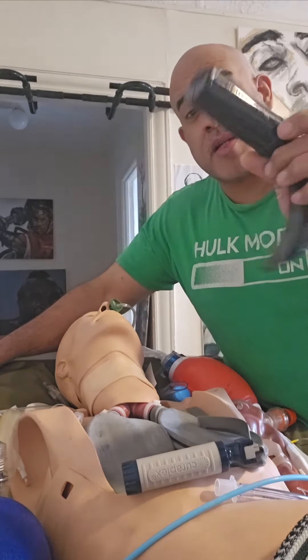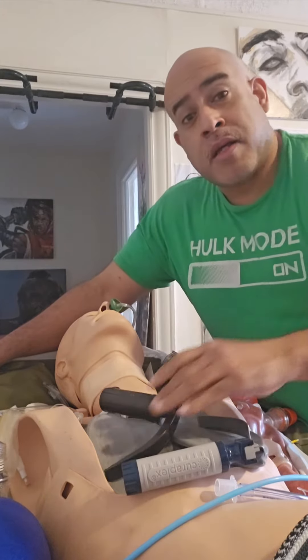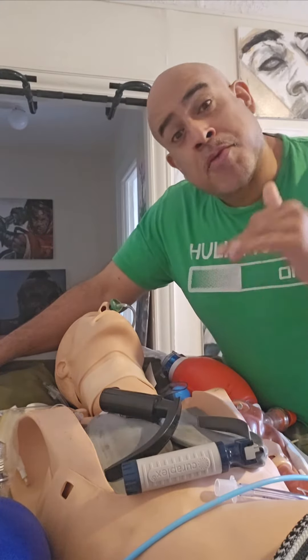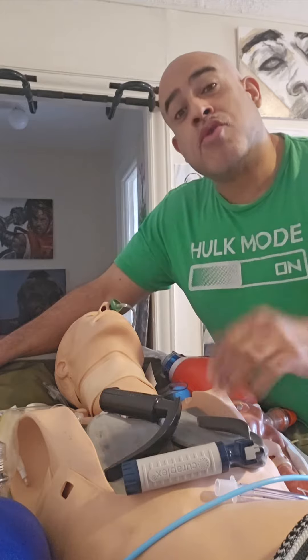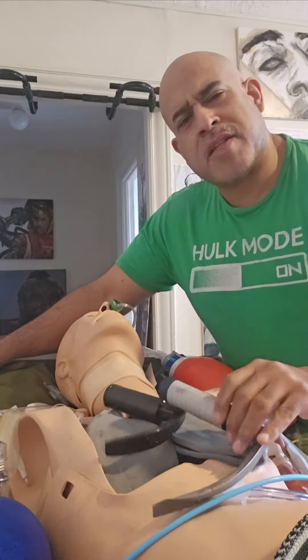The majority of times, I intubate with this blade, because most people in America are between 5 to 6 feet tall. Those are a little longer, more distal — size 4. Make sense?